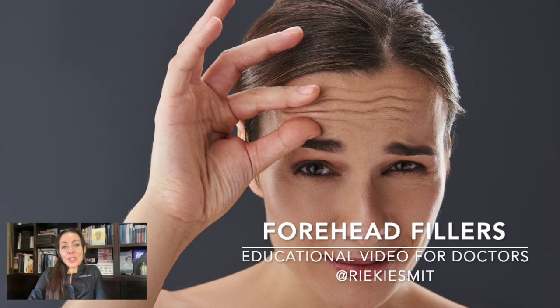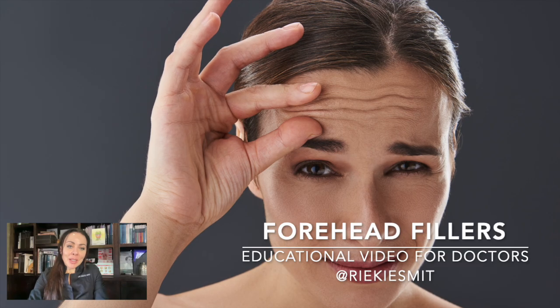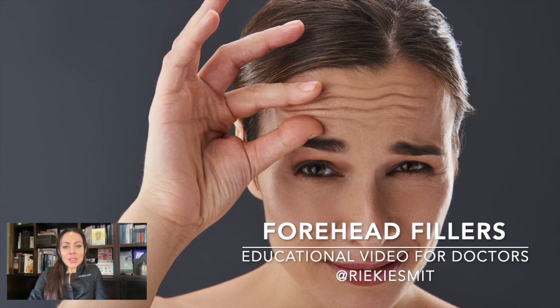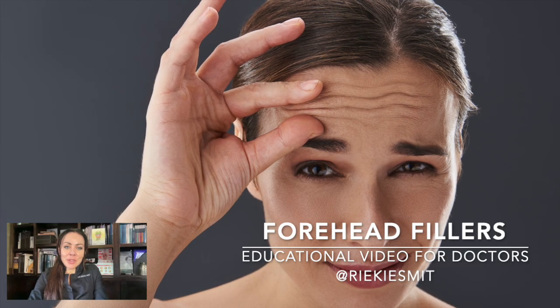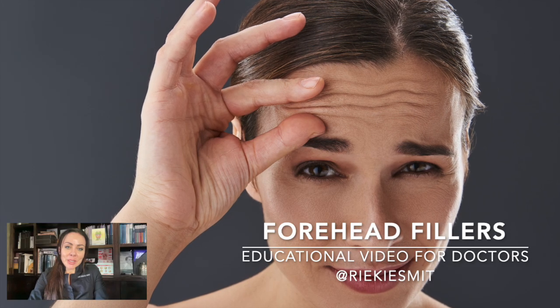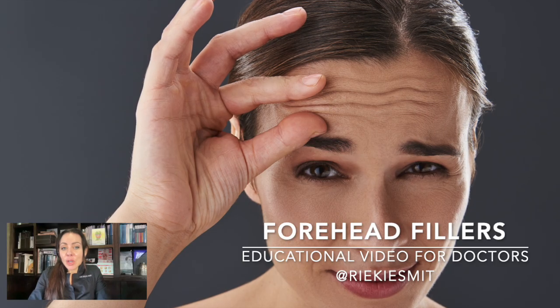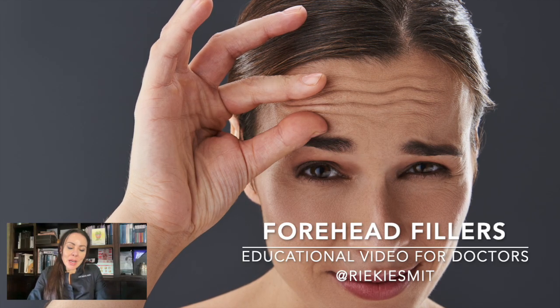This is an educational video for doctors on how to use fillers to rejuvenate the forehead. Let's first look at why we actually do forehead fillers. Forehead fillers are done to either treat wrinkles on the forehead that we don't want to over-treat with botulinum toxin.